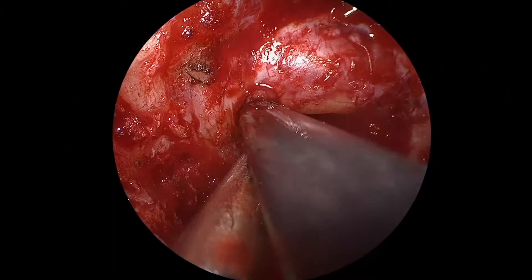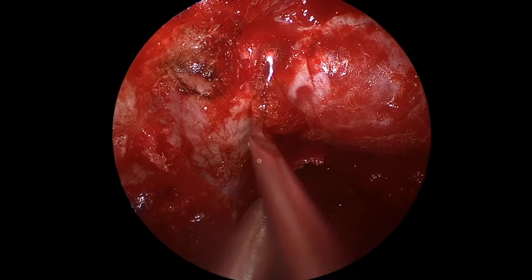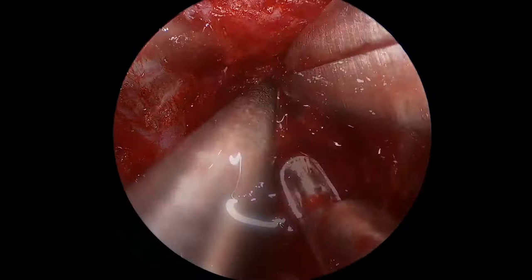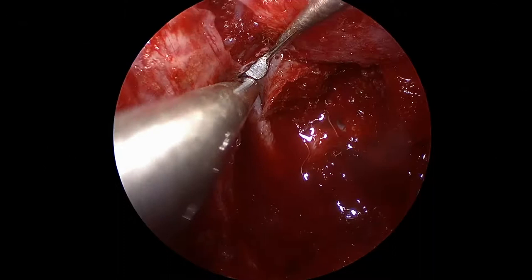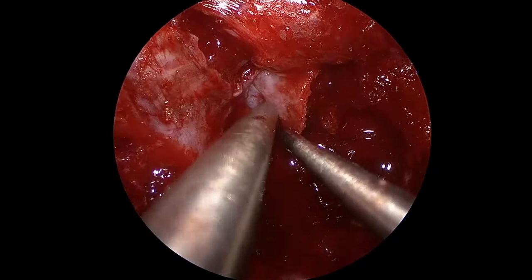The venous bleeding is actually easily controlled with gentle packing. As we open the cavernous sinus, we identify the inferior hypophyseal artery. I'm now opening the anterior wall of the cavernous sinus superiorly, all the way towards the clinoidal segment of the carotid artery. We are now cutting the floor of the cavernous sinus, giving access to the posterior clinoid. We see tumor invading the posterior clinoid. This happens to be a very prominent posterior clinoid, with a large inferior hypophyseal artery located just above it.